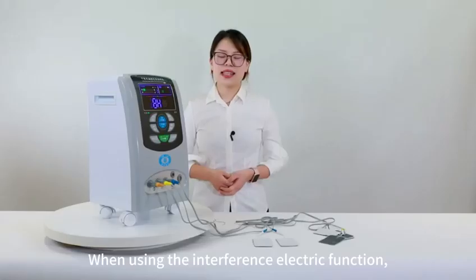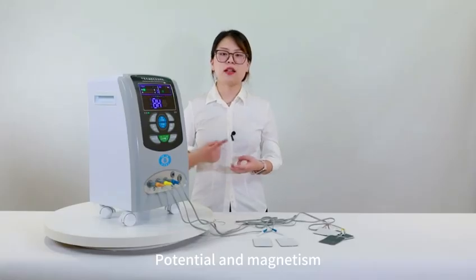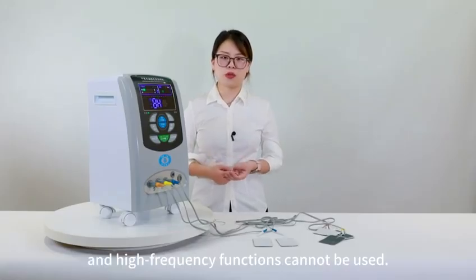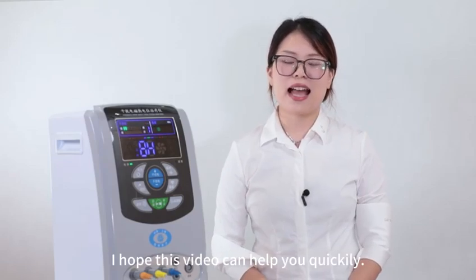When using the interference electric function, potential, magnetism, and high frequency functions cannot be used at the same time. Okay, the above is the operation instruction of the interferential current magnetic thermal potential therapy device. I hope this video can help you get started quickly.